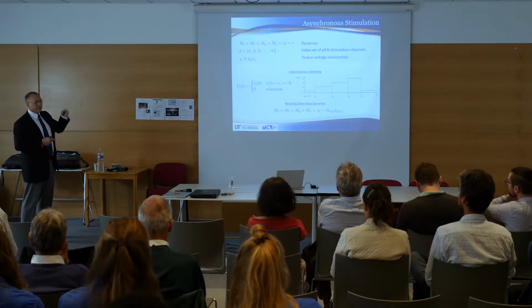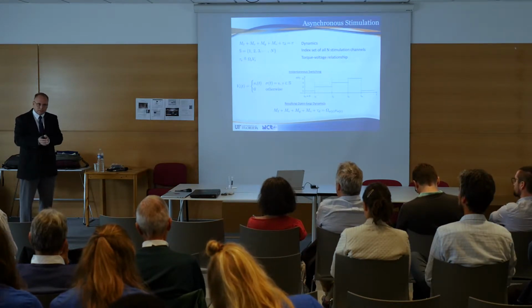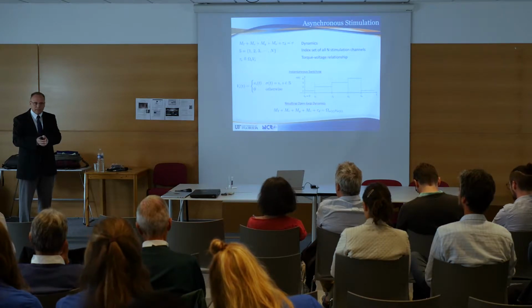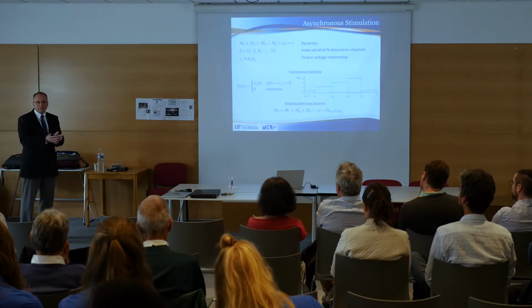That's nice, but breaking the channels up across the muscle means that now I have to switch between different groups of muscle fibers. There may be some overlap, but in switching like this, now I have to take that switching into account. And so, in fact, you can think of it as switching between almost like different motors that will control the nonlinear dynamic system, because each set of muscle fibers that are affected by the channel have different characteristics.